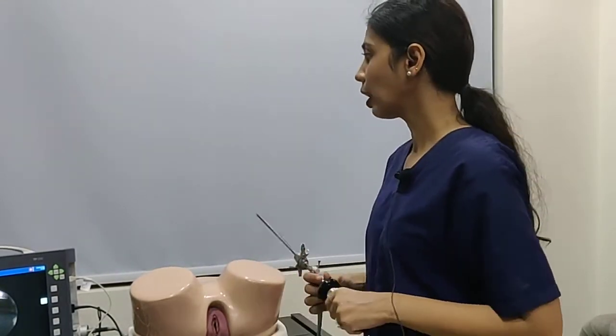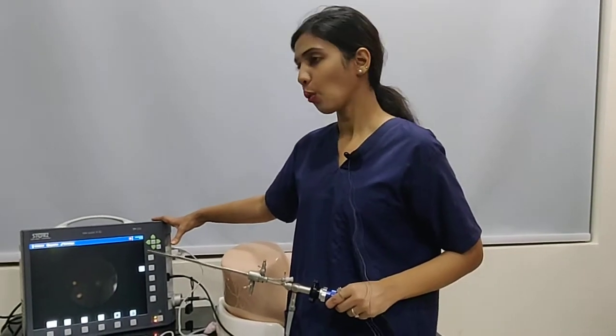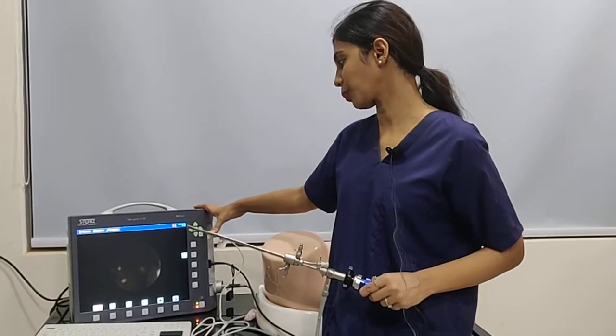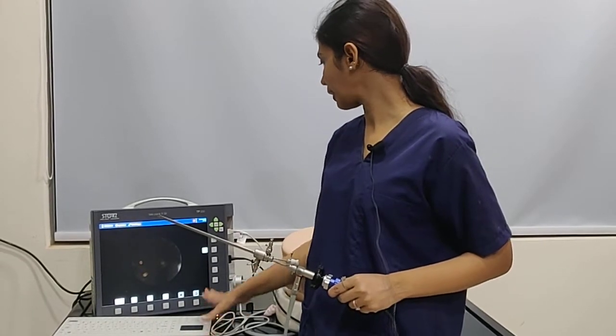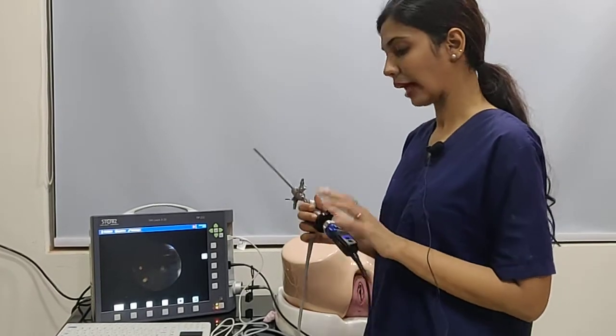Here we have the Telepac XGi from Karl Storz, which is the best system for office hysteroscopy. It has a monitor, a system for storage as well as recording, connections for the light cable, and a camera system.